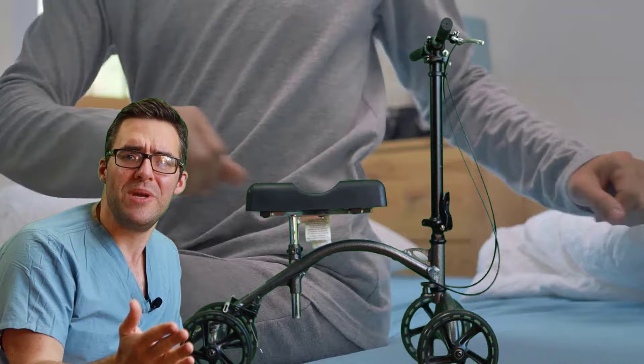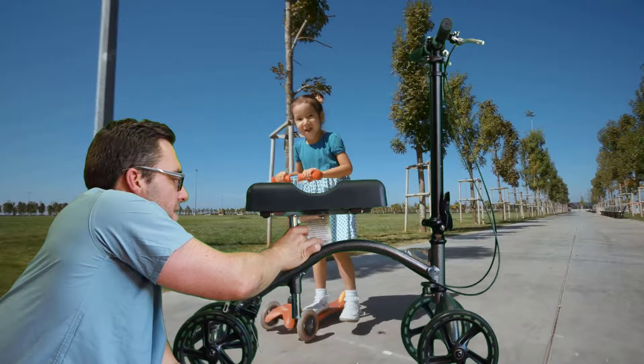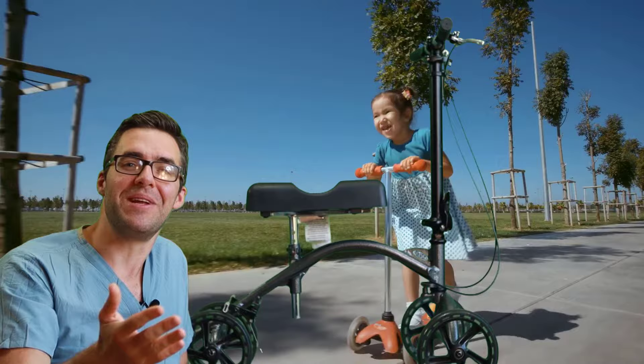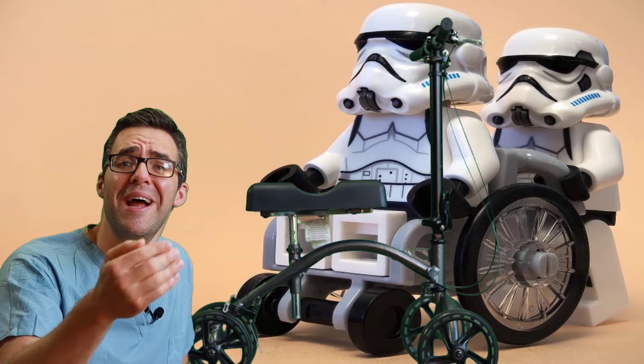Make sure all the adjustable pieces — see this nut and bolt right here — are not loose when you get going. That can fall apart while you're moving and that can hurt you. This happens all the time to patients. They have a broken foot or broken ankle and they end up falling off their knee scooter, causing even more damage. So make sure it's all tight.